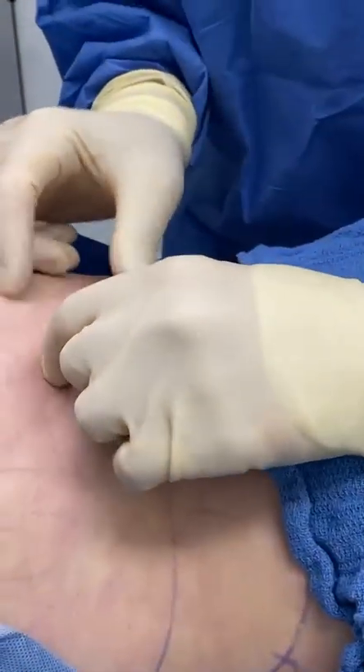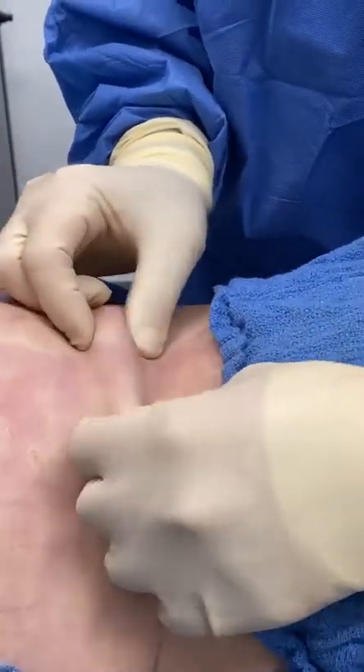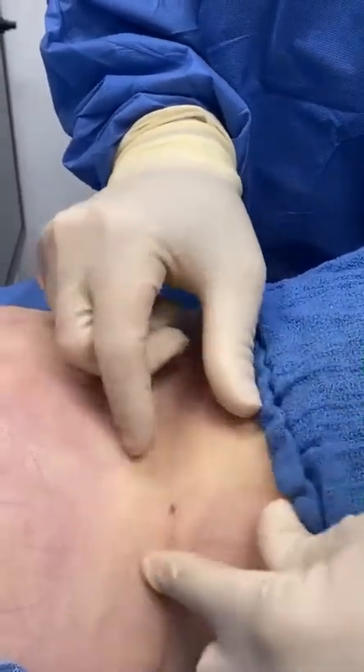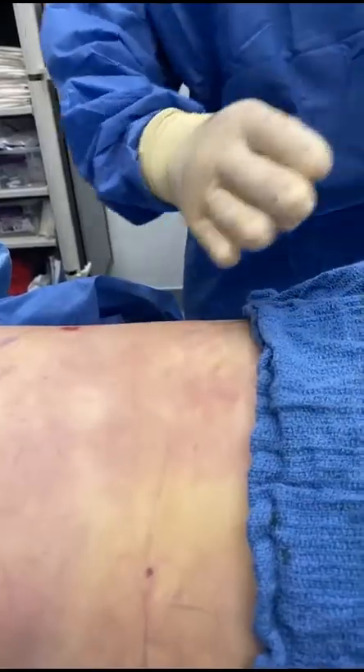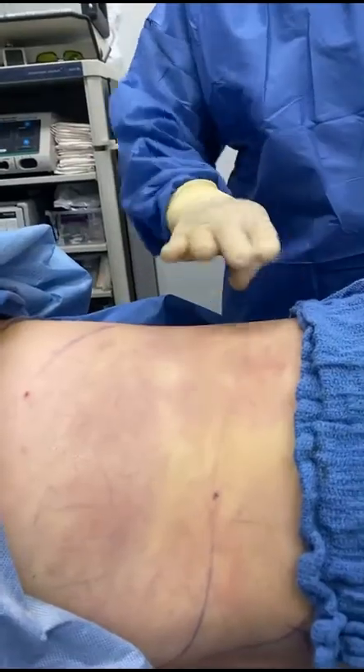Now we're done. This is what I was trying to show you — no excess fat here at the Cosmetic Surgery Center of Posterito. This is just incredible — anywhere you go, no excess. And look at the nice waist that we now have. This area is now going this way instead of going down.